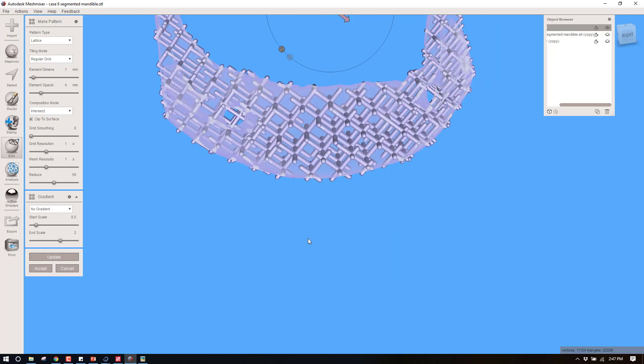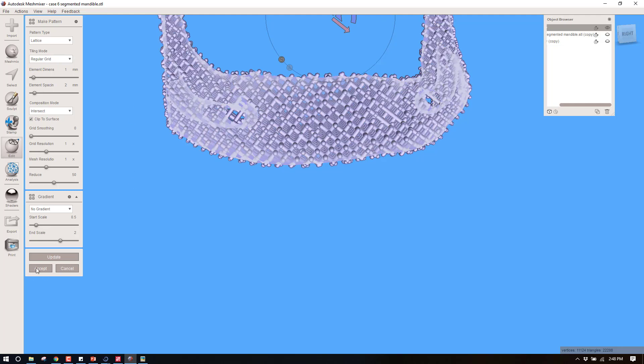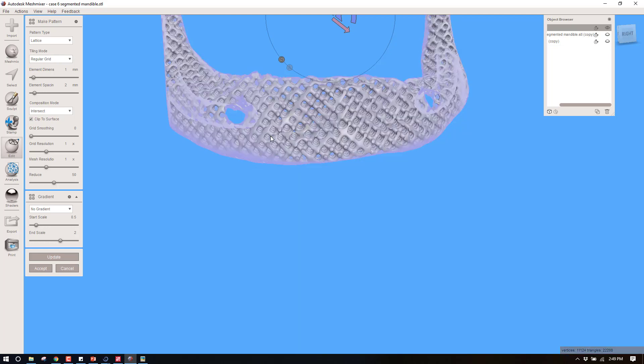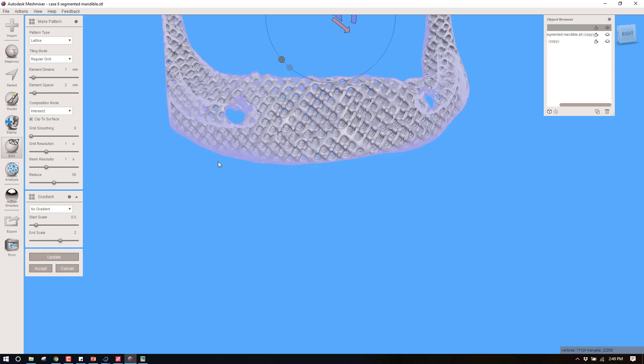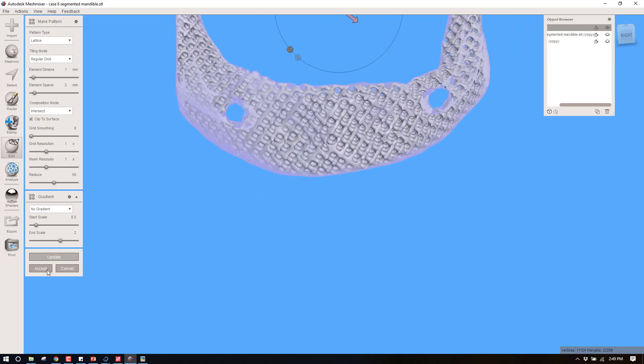For a very spongy maxilla maybe you just do something like this and that's going to give the effect of not having to drill as hard into this. If you want something a little harder to drill through but still have a lot of cancellous space in there, we could maybe change this to two millimeters for our element spacing. Okay, so this is updated. I'm going to accept it.